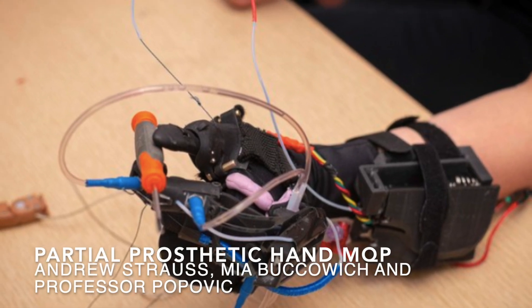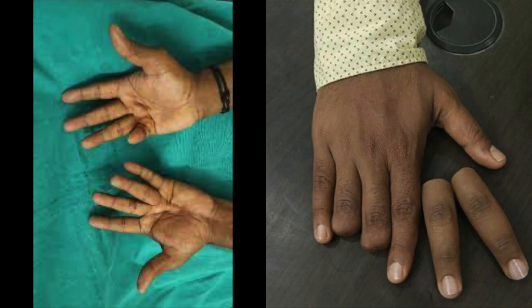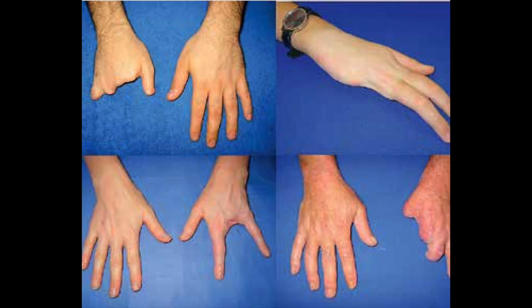About 61,000 partial hand amputations happen in the U.S. every year, leaving victims with heavily compromised dexterity. Despite heavy research in the area and many companies offering solutions for both arms and legs, there are few options that restore dexterity for these partial hand amputees, especially for those missing their thumb.